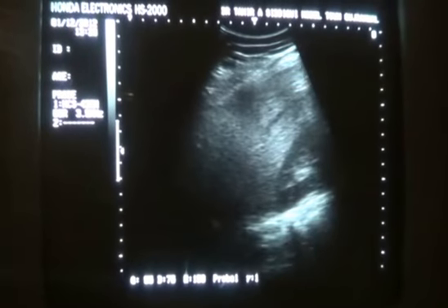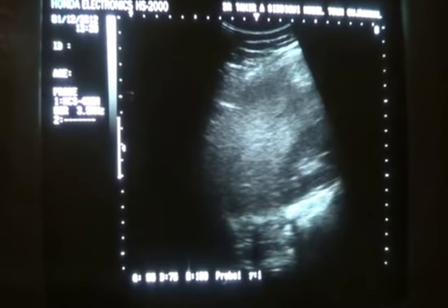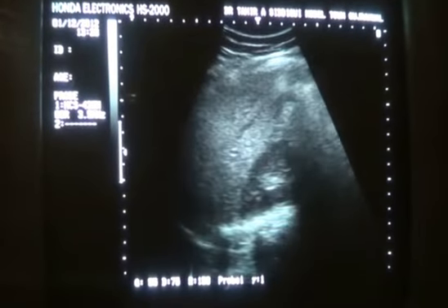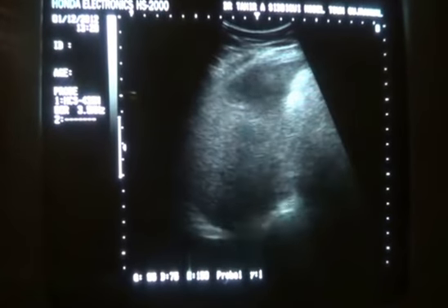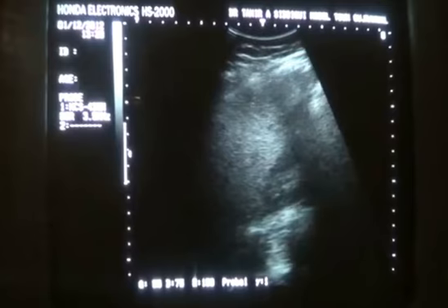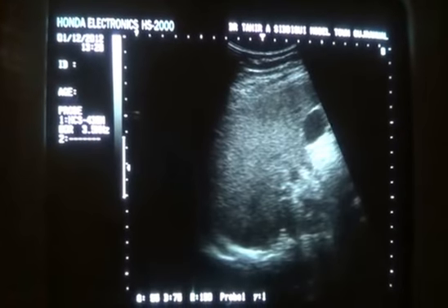There are certain parameters to define this, which I have already uploaded in many video segments, and I will repeat it as it has been requested. Thank you very much. This is part 1. Here we are seeing the normal liver. Thank you.